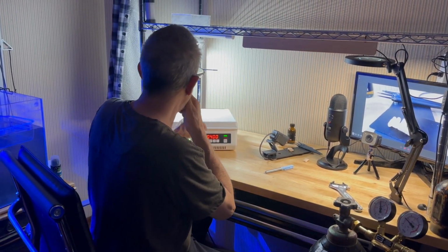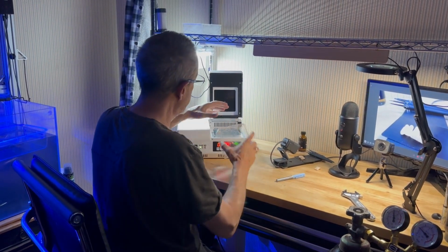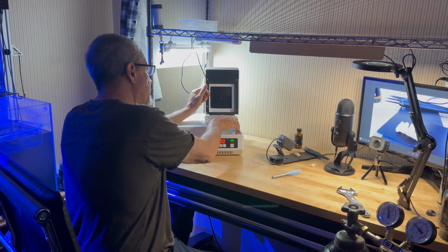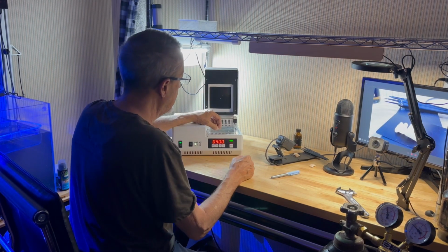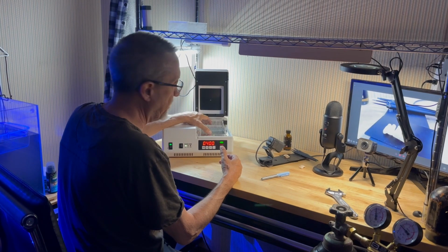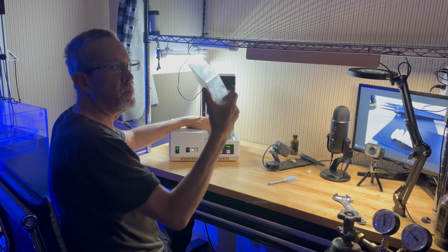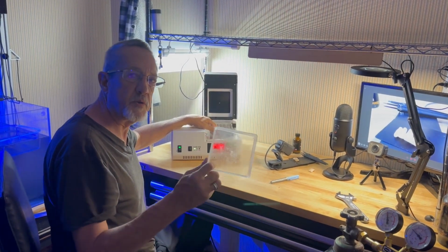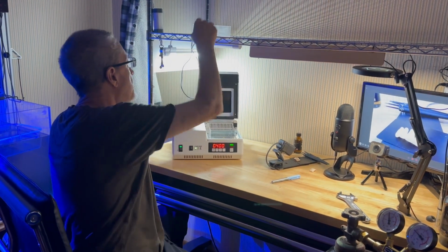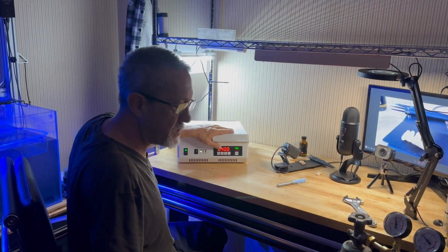The other thing is these trays expand and contract. They're flexible. Now this chamber gets extremely hot. I would recommend that you leave those trays in there to cool and expand and contract on their own, instead of pulling them out and super cooling them. I think that led to some initial cracking in our first tray. Was just pulling that in and out rather than pulling your project out by itself. So I don't know if there's anything else to go over on that one.